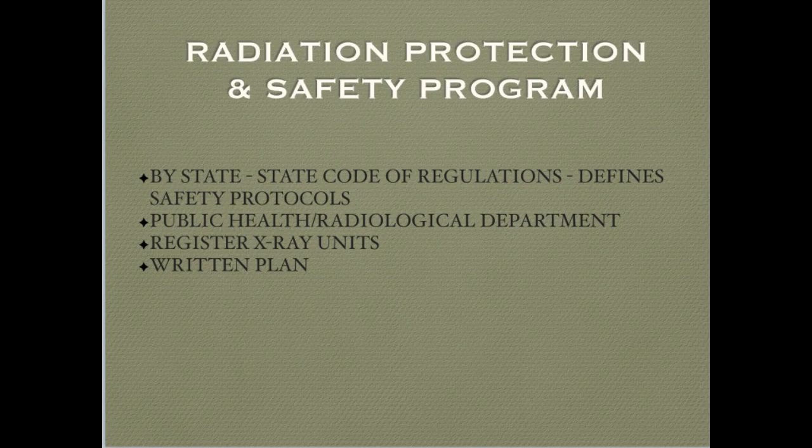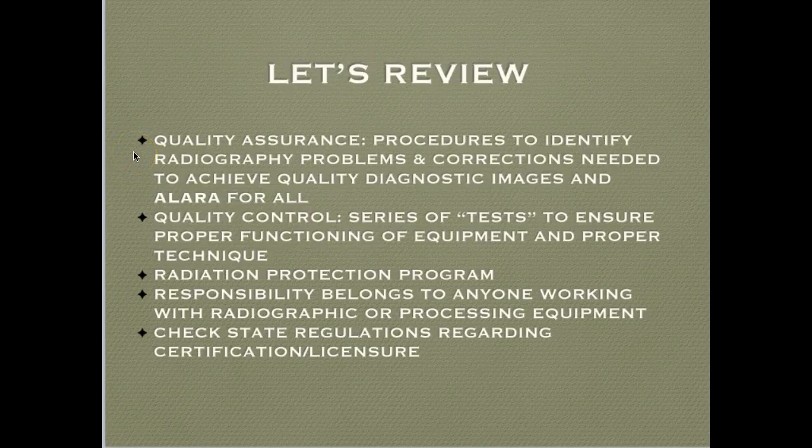Radiation protection and safety program. You want to look at your state to see if there is a state code of regulation that defines safety protocols. You also want to check with the public health radiological department for any regulations that they may have in your county, and make sure that your X-ray units are registered within your state or county, and that you have a written plan for safety. Any training, your quality assurance, your quality control tests can all be included in your written plan.